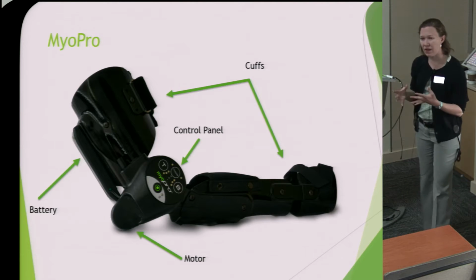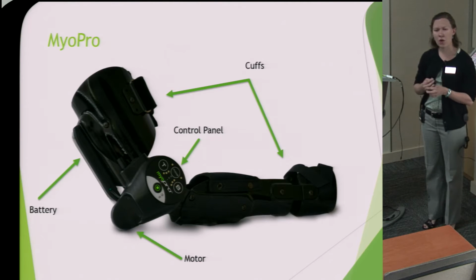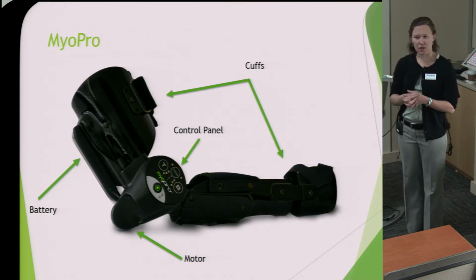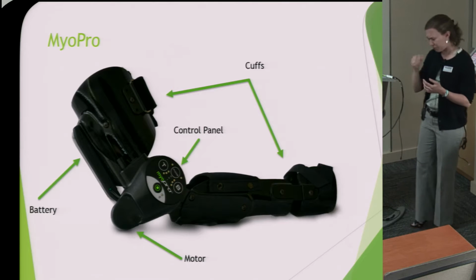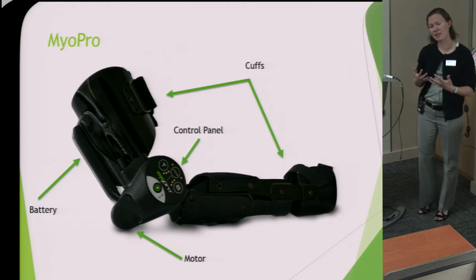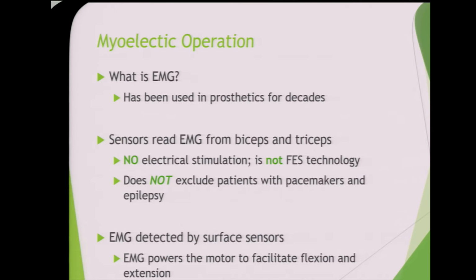This is a plastic device, so it has a little bit of weight to it. It's about 2.5 pounds or so. We're able to offset that through a harnessing system if that's needed, so that it does not pull on an otherwise compromised shoulder. But honestly, once it's custom fabricated for the patient, the weight tends to go away. We have not really had anybody who has said, oh my gosh, I can't wear this because it's too heavy, with the exception of maybe 1 or 2 MS patients, but they tend to have weight toleration issues anyways.